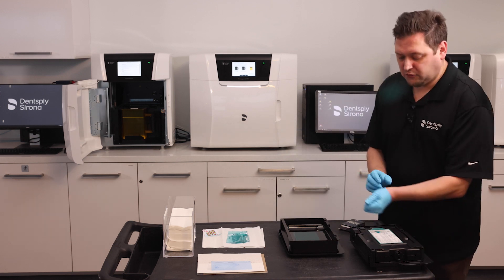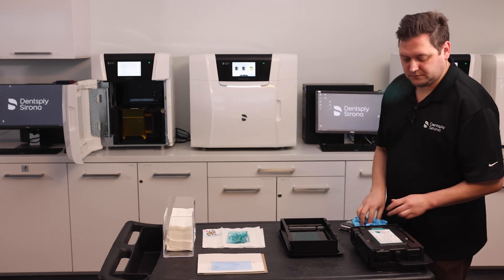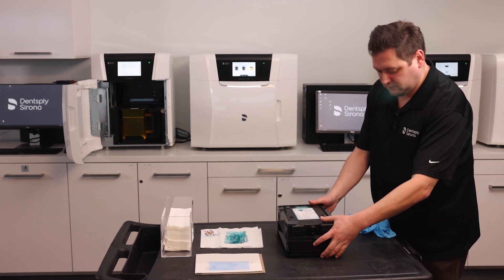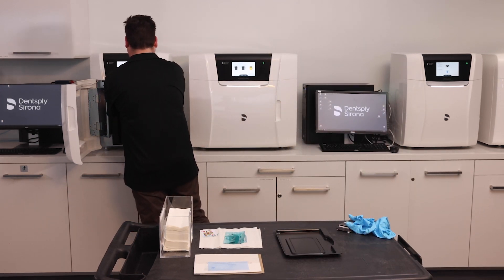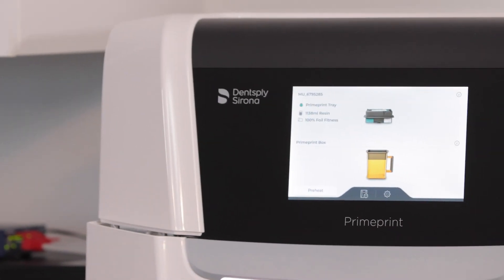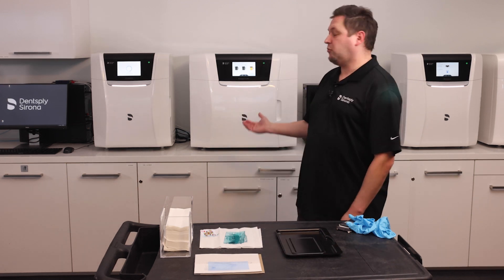Now I reattach my prime print tray, push down, and reinsert it back into the prime print. The object has been removed and the prime print is ready to print.